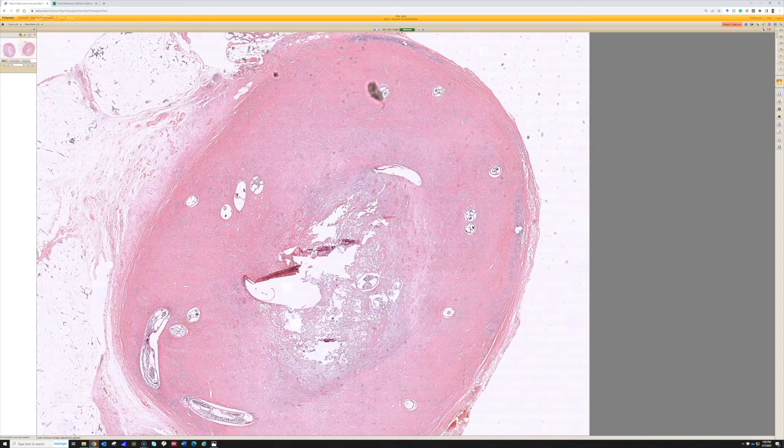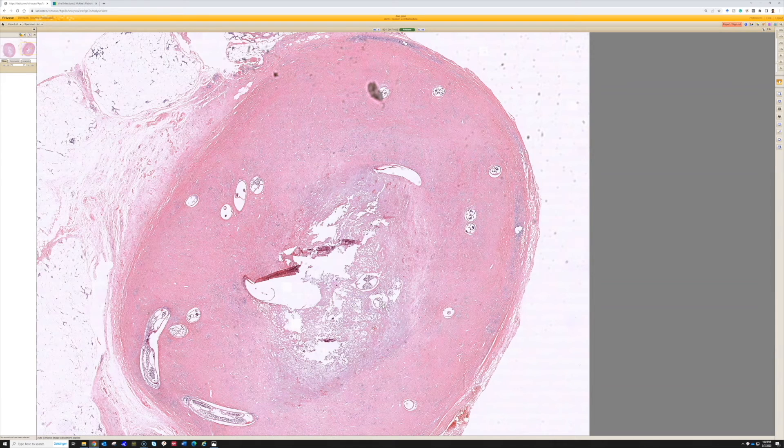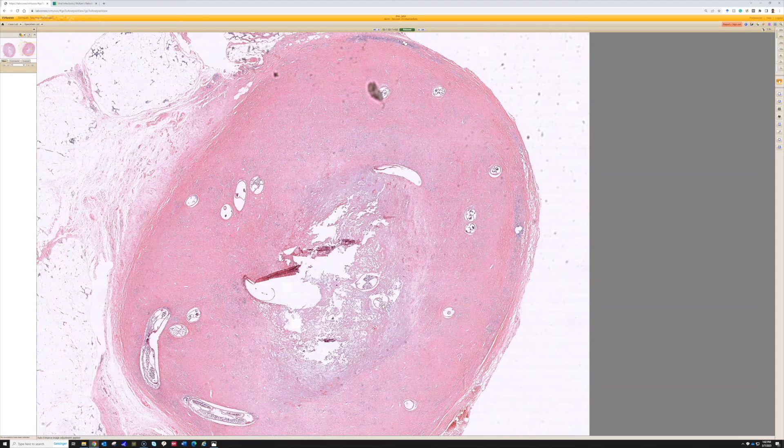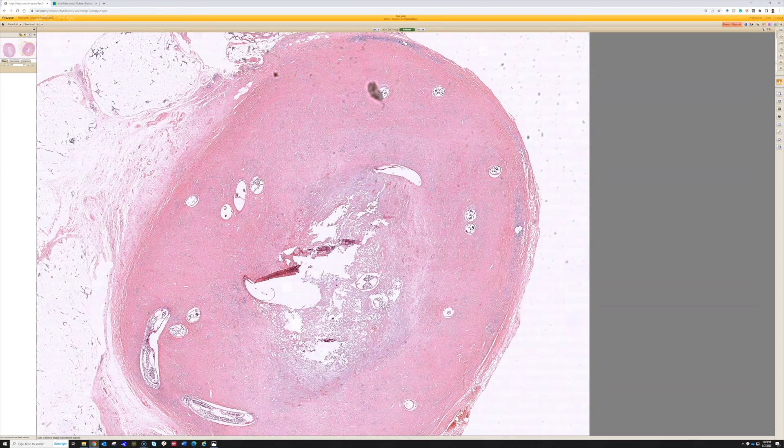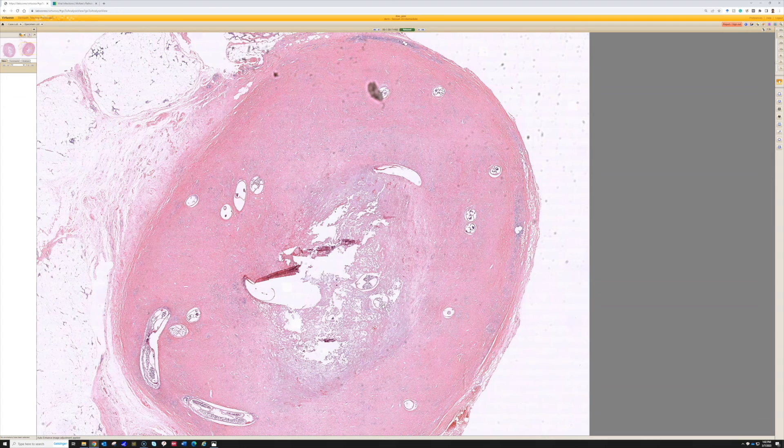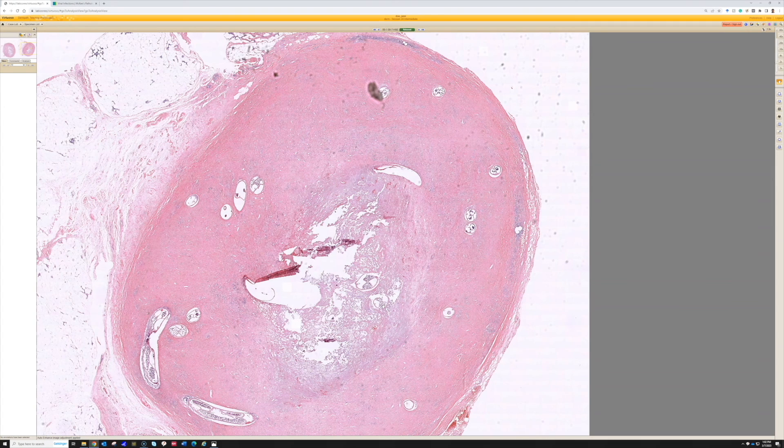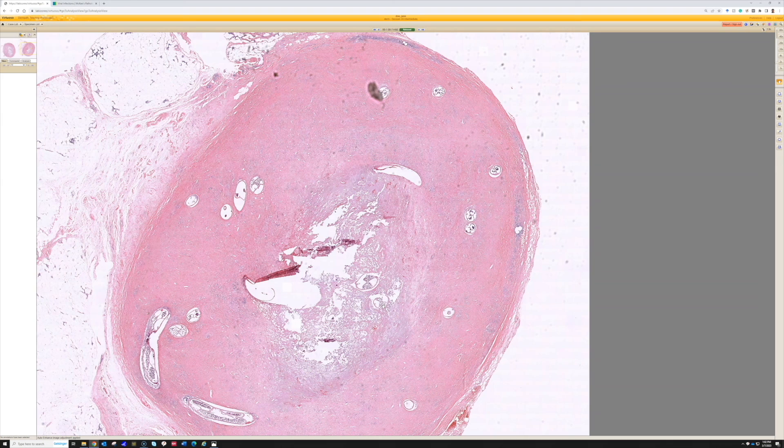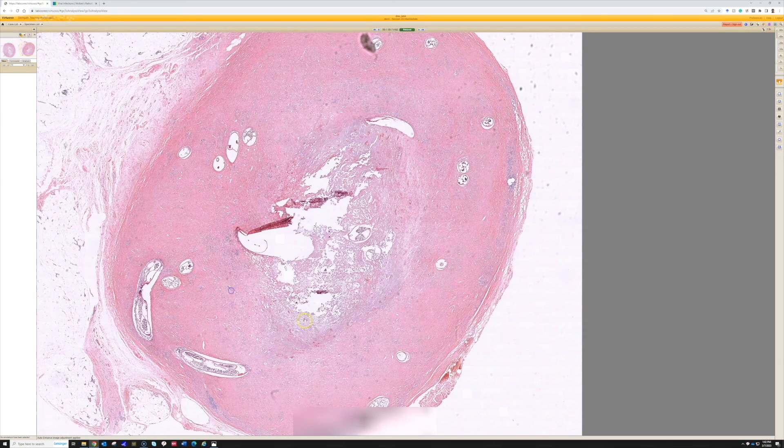And you get a similar looking nodule to what you see here. Although the rare cases I've seen, the worm was like a degenerated kind of necrotic fragment of worm, but it's surrounded by a very similar ball of fibrosis, inflammation, fibrinoid necrosis, and granuloma. So that is another thing I've seen that looked maybe a little similar. And I'm sure that there are a variety of other worm or filarial type processes that could cause a similar reaction pattern from the human body.